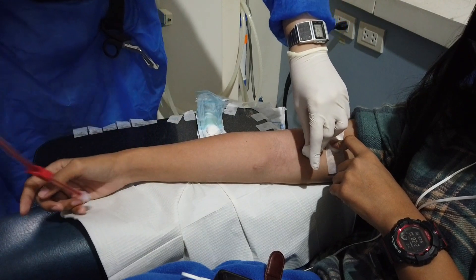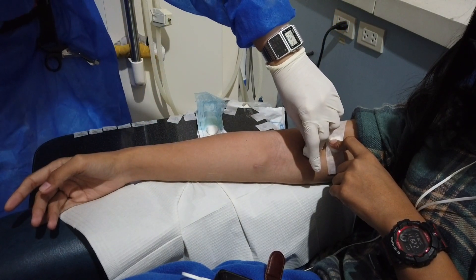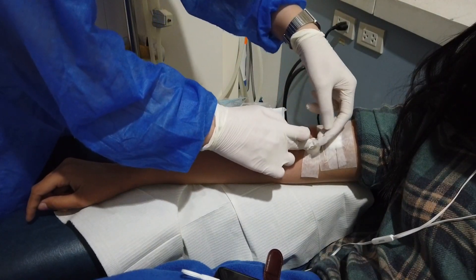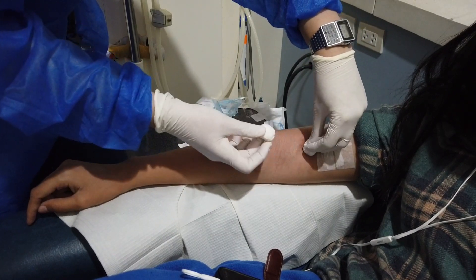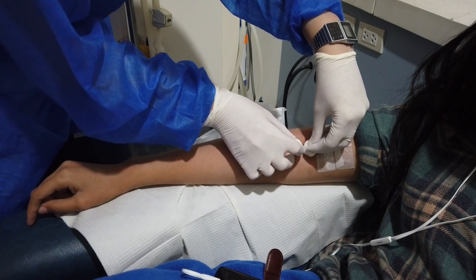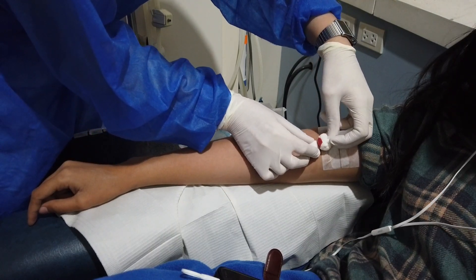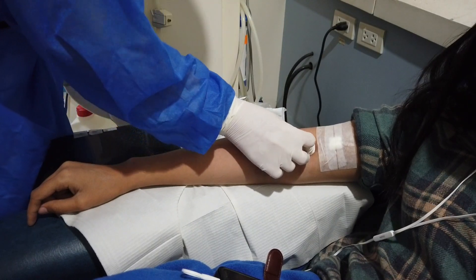Make sure to prepare the sharps ahead to discard the fistula needle immediately after removing. Placing the fistula needle somewhere, even away from the patient, is still too risky. The arterial site clots longer than the venous, so here you can see that I use two round PDs just to make sure that bleeding has stopped. I don't half-remove the PD to check the site if it's still bleeding. Rather, I slide in a fresh PD below the old PD on the side where the needle was inserted, to avoid the tendency of reopening the formed clot.